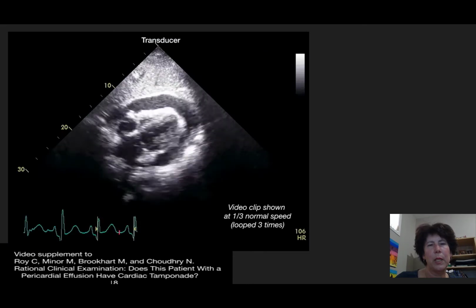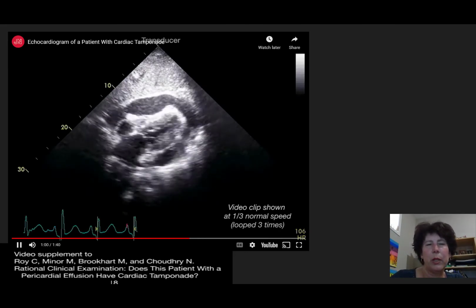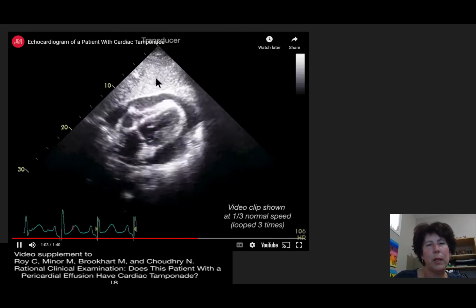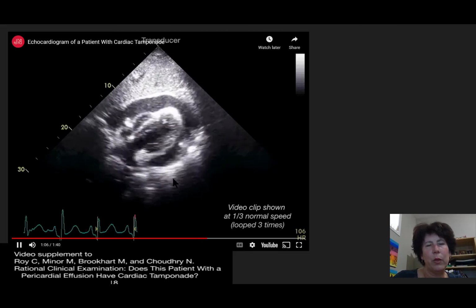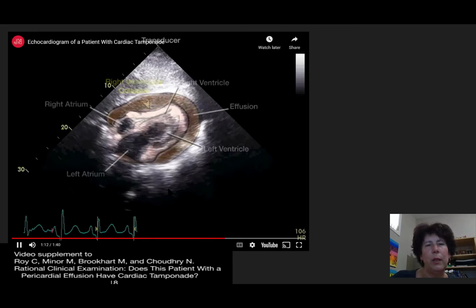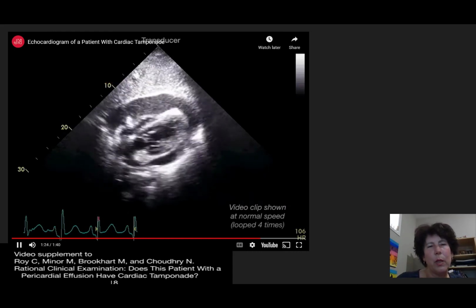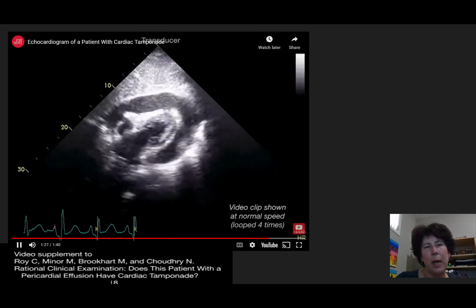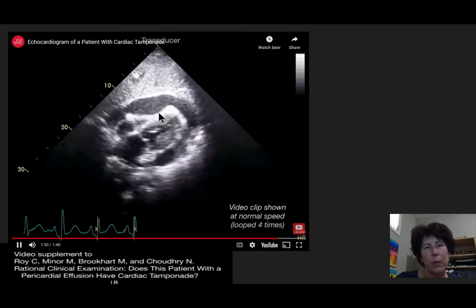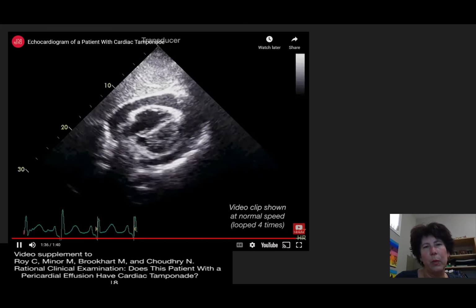So we're going to look at this pericardial effusion and its effect on the cardiac contractility during the cardiac cycle. This is a subcostal view. You can see the liver here, full circumferential pericardial effusion. And so we're going to look at those right-sided chambers. And they're going to help us with that, put a picture over the top here and show us this right ventricular collapse as the pressure in this fluid exceeds the pressure within the RV. And that is a hemodynamically significant pericardial effusion. So just keep an eye on that. Right ventricular and right atrial collapse. Okay.